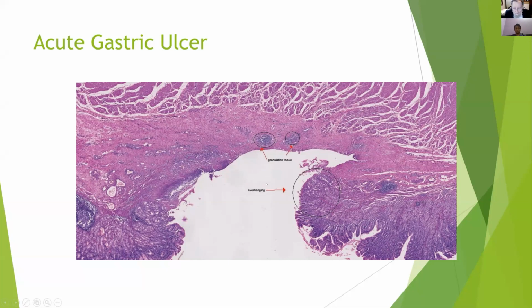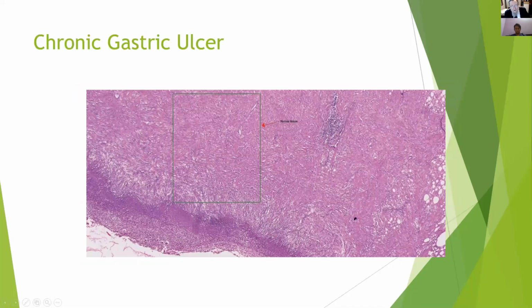So this is a greatly improved presentation. For those who are particular and experienced, this slide is upside down. This is mucosal surface. This is the ulcerated area going downwards, which in this slide is upwards, just to orient you. Same thing for a chronic ulcer. Here is the box the students put in. Here is fibrous tissue. Here's an arrow. Here's a label. So you have an improved product.